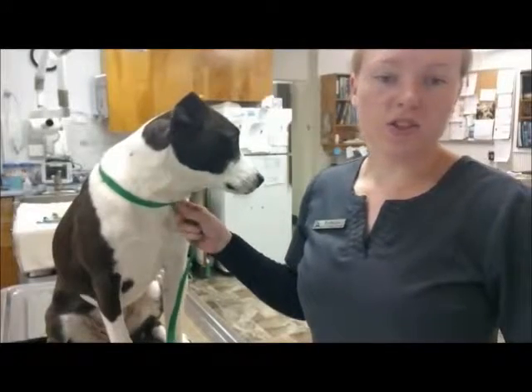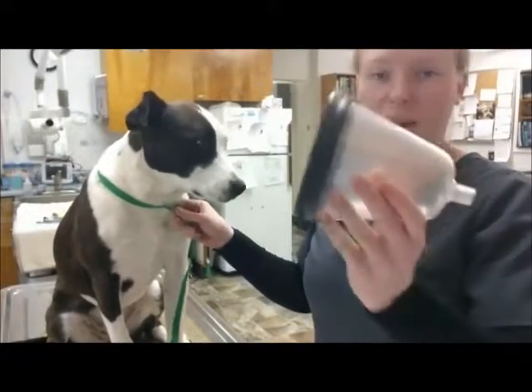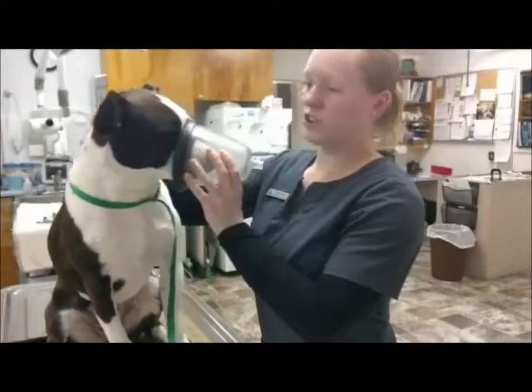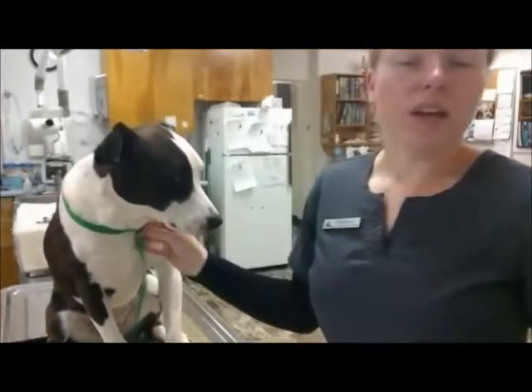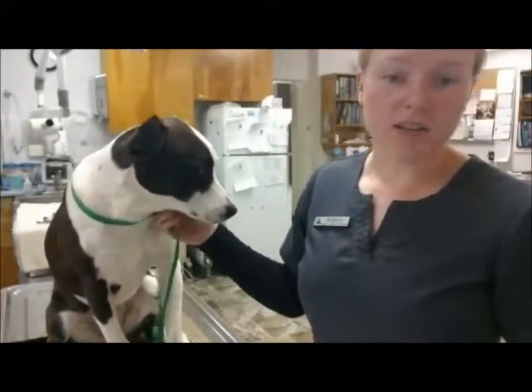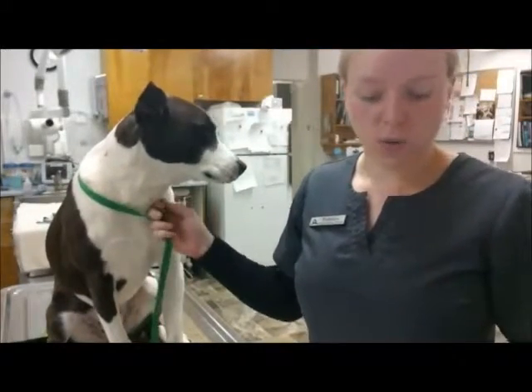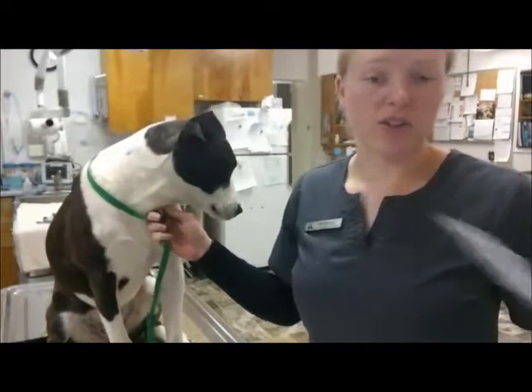Methods of providing oxygen to patients may include a mask, which can be applied as so, a nasal cannula, an oxygen cage, or by direct tracheal intubation.